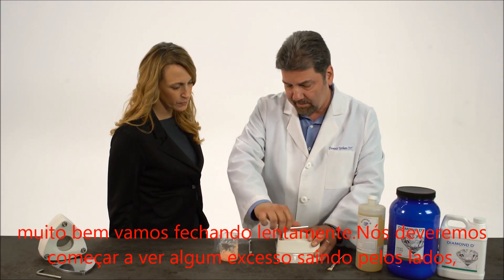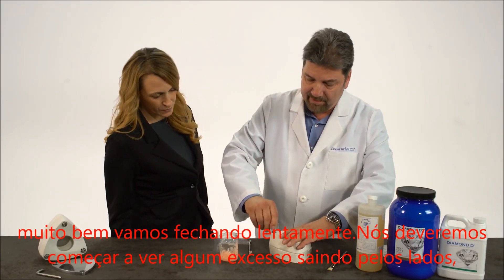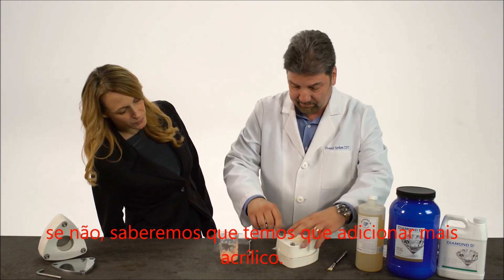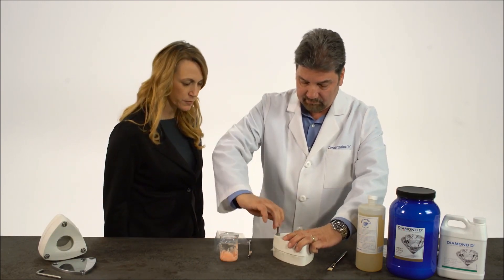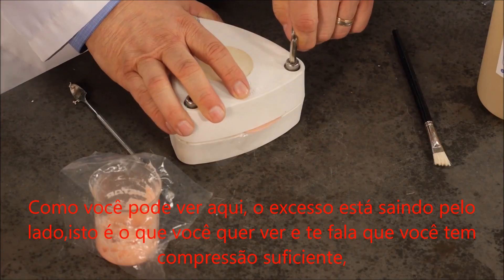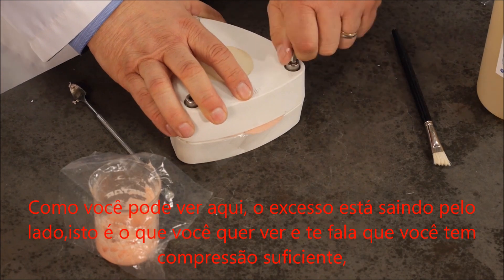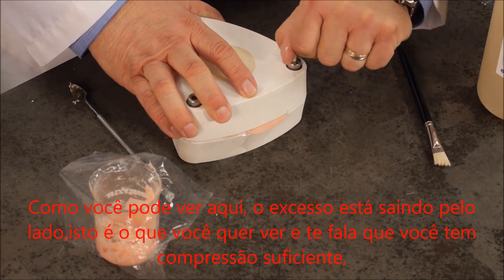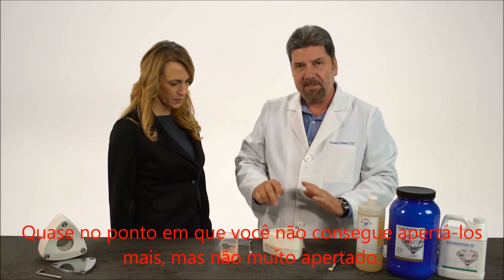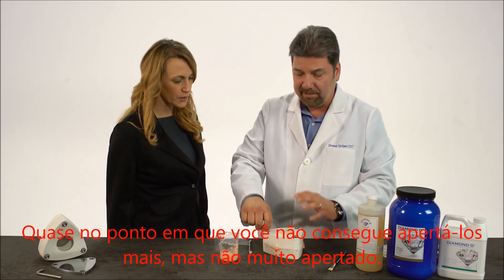We just tighten it slowly. We should start seeing some excess coming out of the sides. If we don't, then we know we have to add some more acrylic. As you can see right here, that excess is coming out of the sides. That's what you want to see, because that tells you you have enough compression. I'm not going to tighten down all the way right now — almost to the point where you can't turn it anymore, but not really tight.